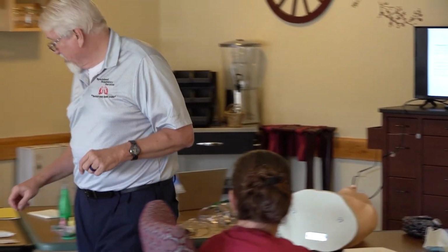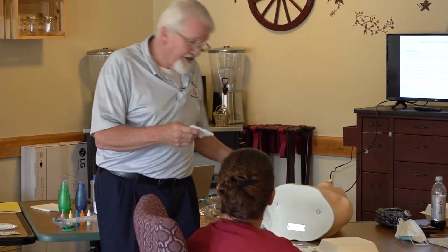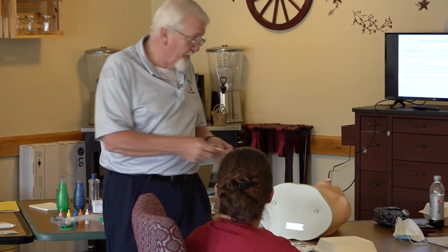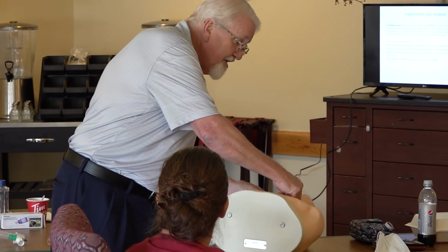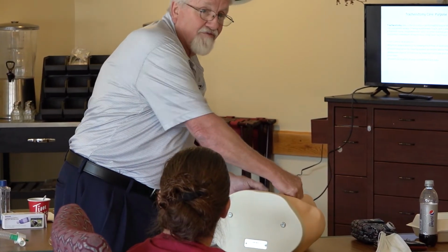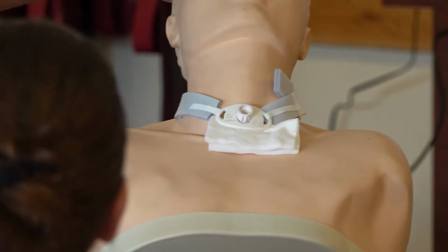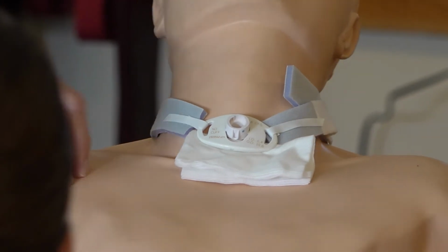Sometimes there's a lot of buildup up under there, and you may actually have to take a 4x4, fold it in half, moisten it, and then just slide it up under the flange and seesaw it back and forth to try to get it clean. And I've had to do that four directions with a new cloth each way. Sometimes they can get rather nasty.